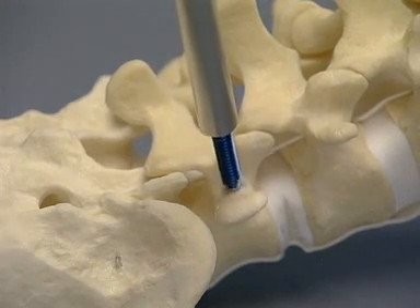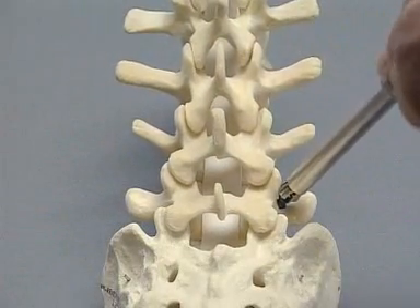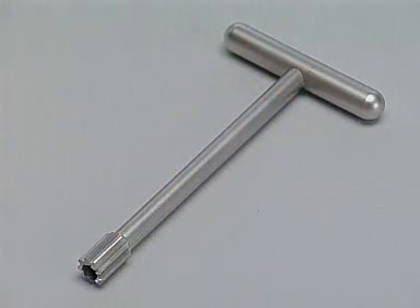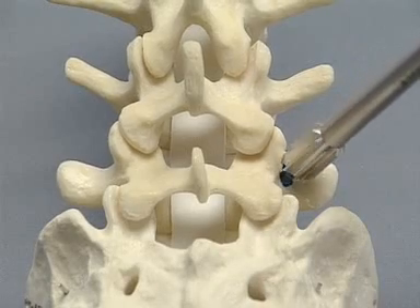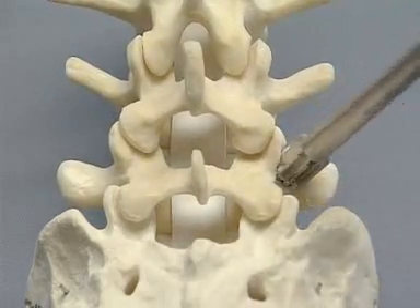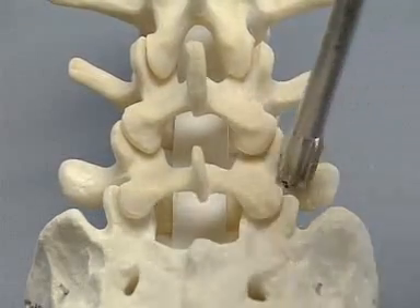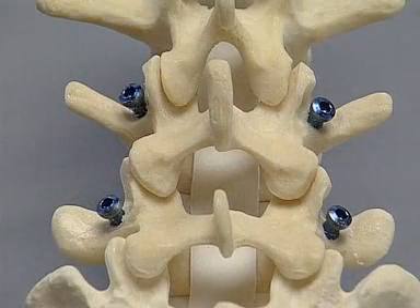As the pedicle screw is inserted, the holding sleeve is released. The screw is not fully inserted — a few millimeters are left between the screw head and the bone. The reamer for the Cliquex is then placed over the screw head and the bone is removed. The reamer is angled 25 degrees in all directions to ensure good clearance of bone, allowing the Cliquex 3D head to be attached to the pedicle screw. A similar procedure is undertaken in the other three pedicles.